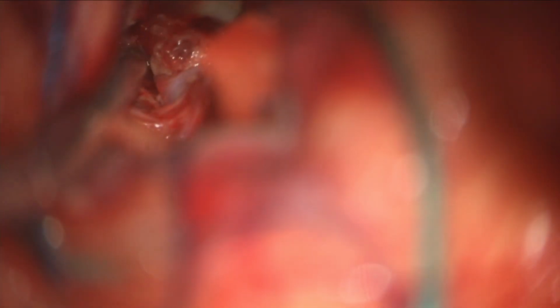Here we're dissecting over the top of the dome, and on the far side you can see a more normal appearing aneurysm. On the near side appeared to be the rupture point, which again is covered with fibrinous material. And being a small aneurysm, this was a relatively straightforward clipping. It was clipped with a single slightly curved clip.